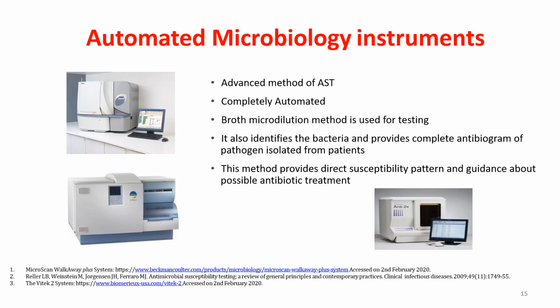Another method of doing phenotypic testing is the automated microbiology methods, wherein we have Vitek and Phoenix and others. They're advanced methods. They're completely automated. Broth microdilution is again the principle of these machines. It also identifies the bacteria as well as provides the sensitivity testing.